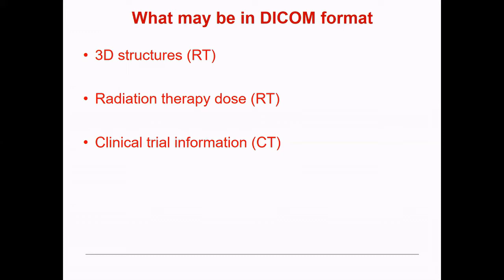And then it's really easy to find software that can help you read DICOM files to see the images. I think one prominent one is 3D Slicer, for instance. That's open source, or MITK. So that's just software that is around that you can download, and then you can look at the images. And oftentimes they have a small component, a kind of DICOM parser, with which you can read out the real DICOM header and see what is where.